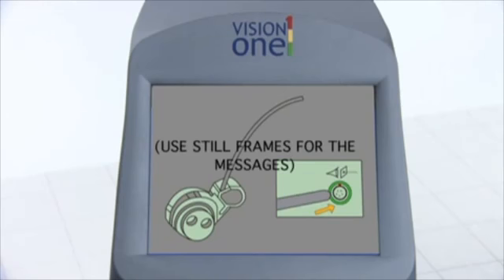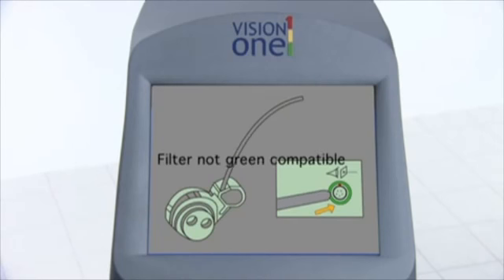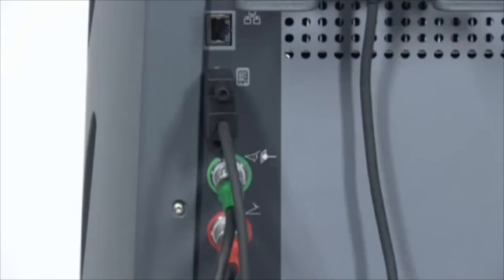If an incompatible eye safety filter is connected to the laser, one of the following messages will be displayed. Filter not green compatible. Filter not yellow compatible. Filter not red compatible. This message will display on the control screen until a compatible filter is connected. After checking all connections, you are ready to turn on the laser.